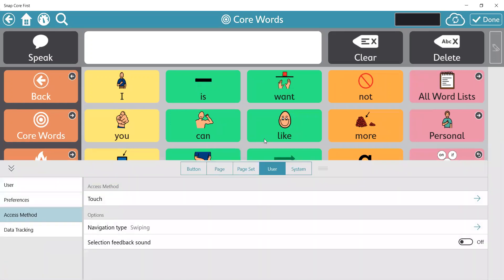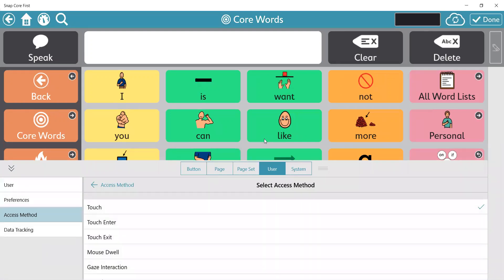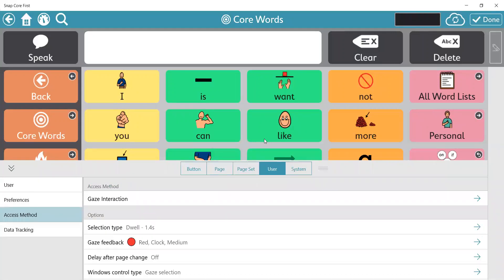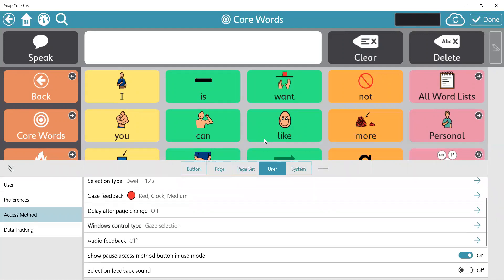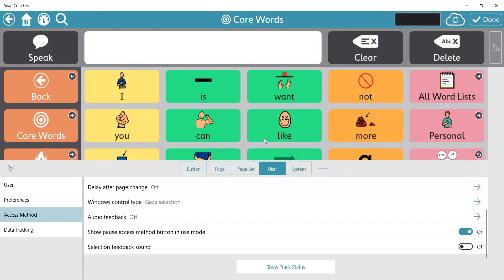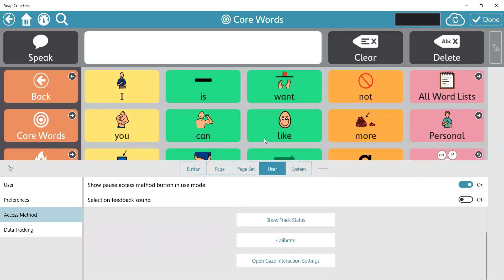Right now it is set to touch, and what I want it to be is eye gaze, so I'm going to click there, click on gaze interaction, go back, and this is where I can find my dwell time, my gaze feedback, any other settings I might need, as well as show my track status, calibrate, and open gaze interaction settings.